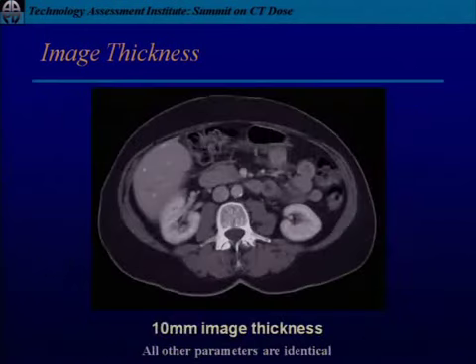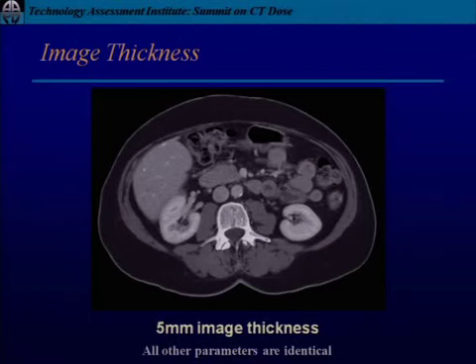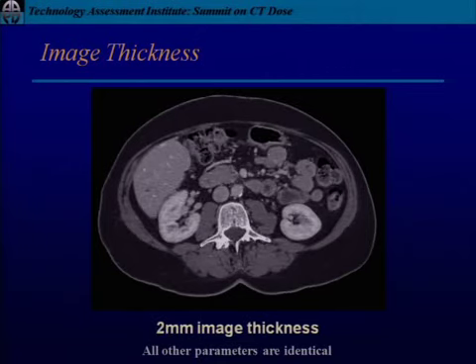Let me show you a clinical example. This is a 10 millimeter thick image, and what I want you to do as I click through and the slices get narrower and narrower, I want you to look at the organ boundaries, and I also want you to pay attention to this area in the liver right here. Okay, here's our 10 millimeter images. We go to 5s, and I'll just click back and forth between this 10, 5. Things are tightening up already, you can see with the 5s. Here's the 2 millimeter images, and look at that spot where I had highlighted. I don't know how well you can see that out there, but there is a little spot there.